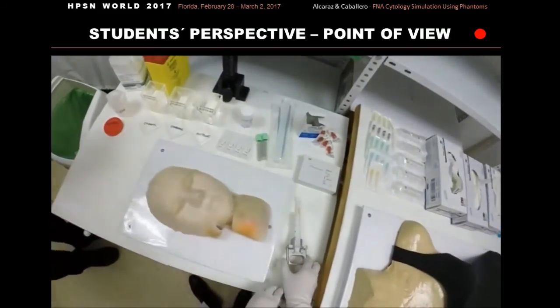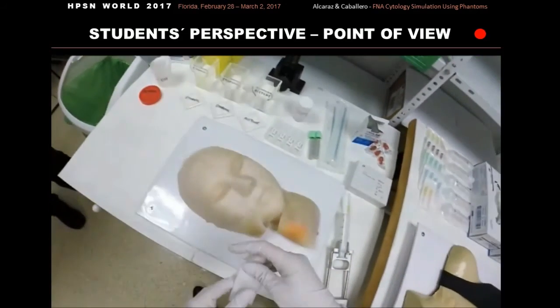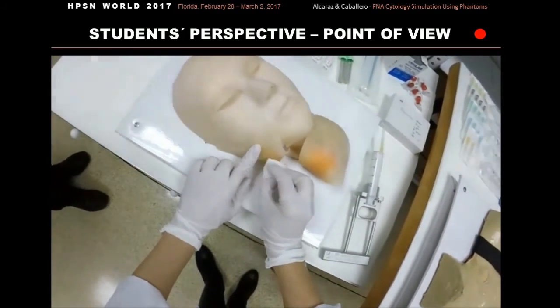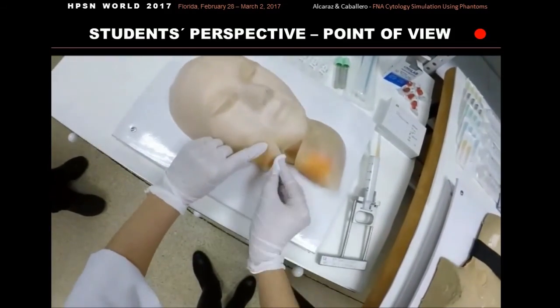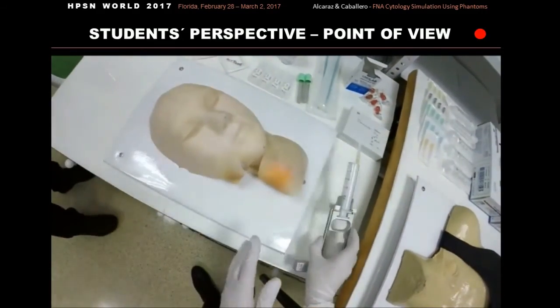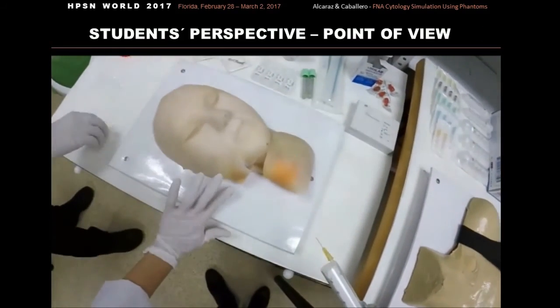We have now to prepare the patient's skin. So the skin is wiped clean with an alcohol swab. Now the student is going to insert the needle within the lesion.